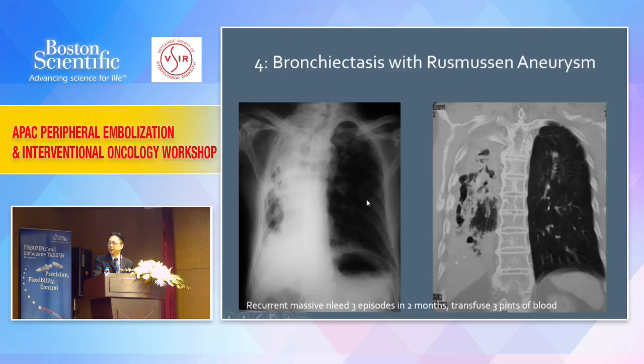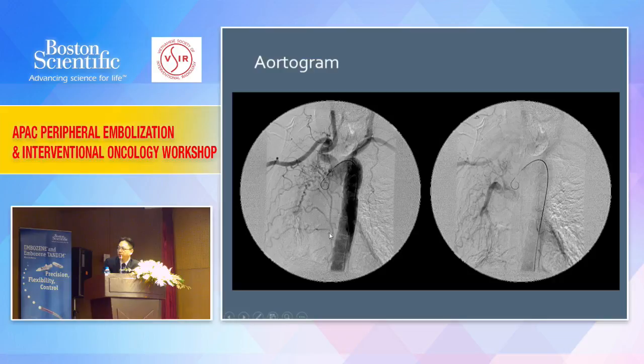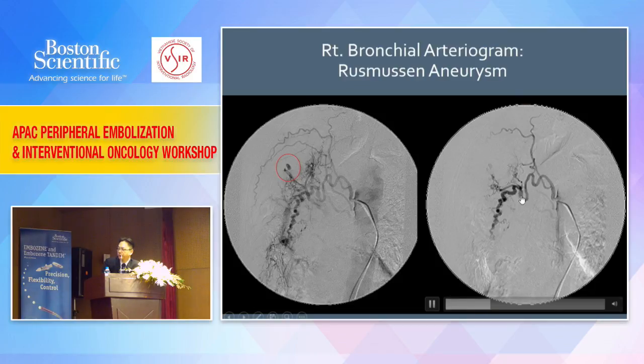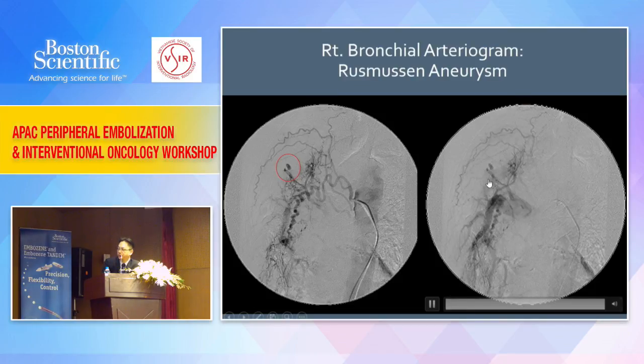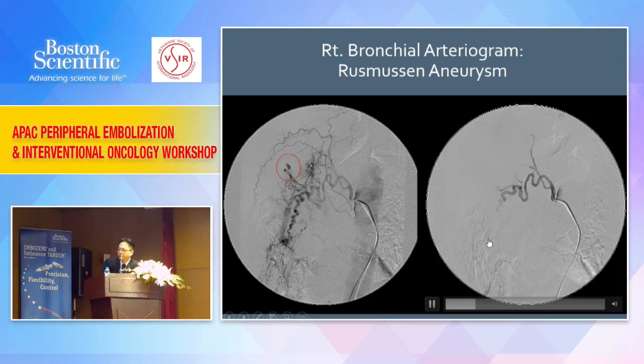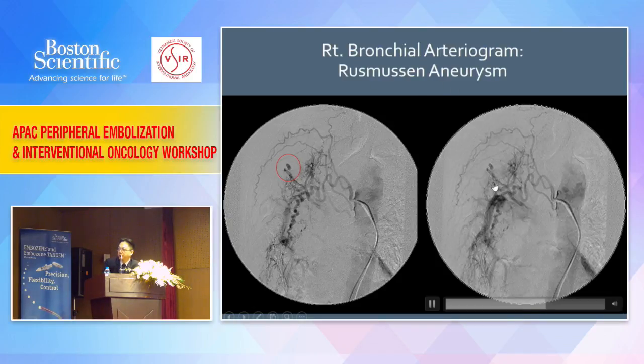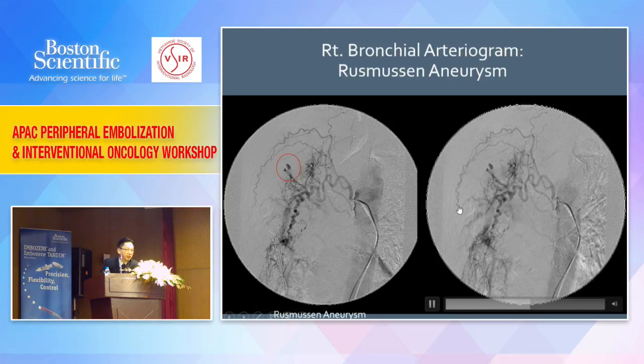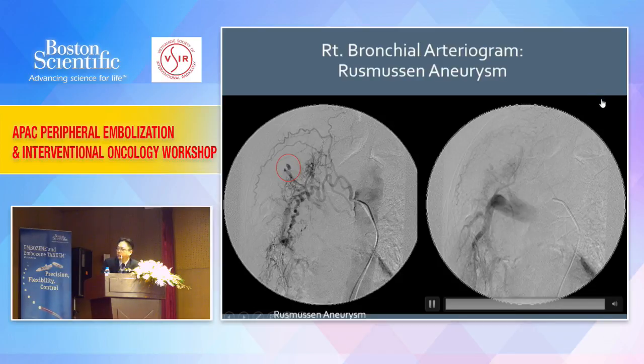Okay. And on the other hand, aneurysms sometimes go beyond what you are seeing in bronchiectasis. Okay, very extensive, massive bleed, 3 pints of blood given already, still pouring away. When you do a bronchial arteriogram, you are seeing this aneurysm here. Okay, and major opacification of the pulmonary artery. These are what we call Rasmussen aneurysms, typically in TB. And if you embolize from the transarterial side, most of the time you will not be able to actually target.